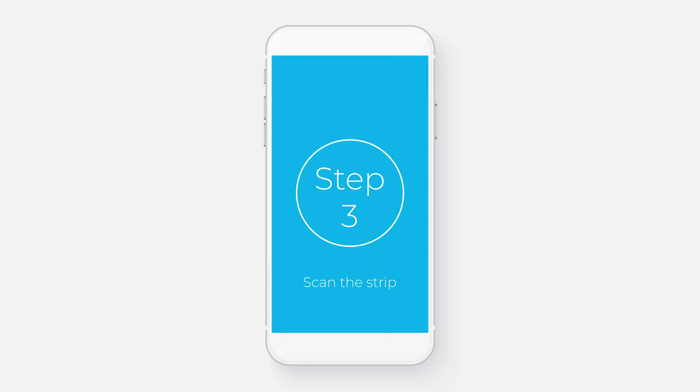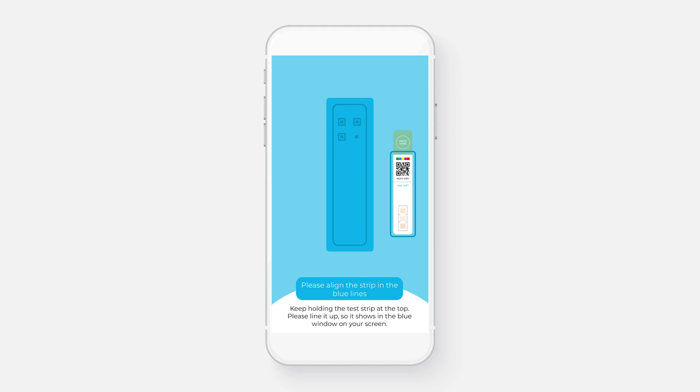Step 3. Scan the strip, still holding it at the top. The app will help you to align it perfectly and will tell you exactly what to do next.